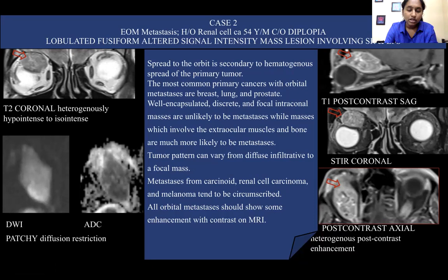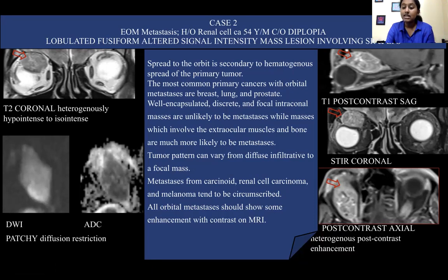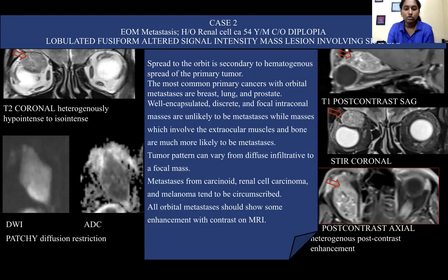Spread to the orbit is secondary to hematogenous spread of the primary tumor. The most common primary cancers that metastasize to the orbit are breast, lung, and prostate. Well-encapsulated, discrete, and focal intraconal masses are unlikely to be metastatic, while masses involving the extraocular muscles and bone are much more likely to be metastasis. The tumor pattern can vary from diffuse infiltrative to a focal mass. However, metastasis from carcinoid tumors, neuroendocrine tumors, renal cell carcinoma, and melanoma tend to be circumscribed, as seen in our case. All orbital metastases should show some degree of enhancement with contrast on MRI.